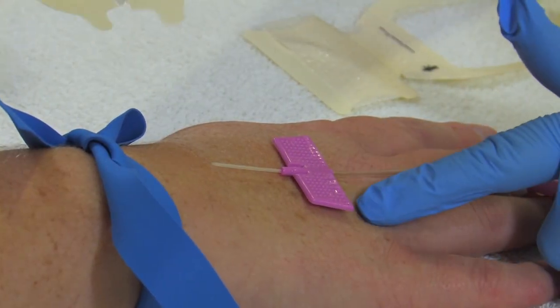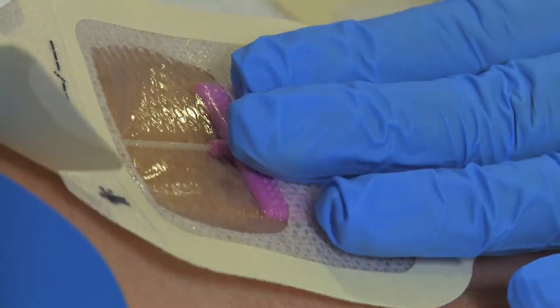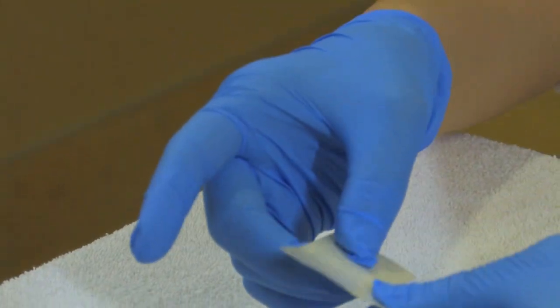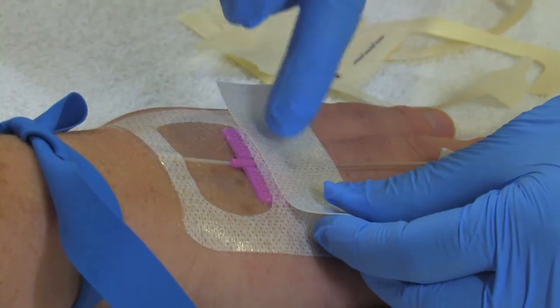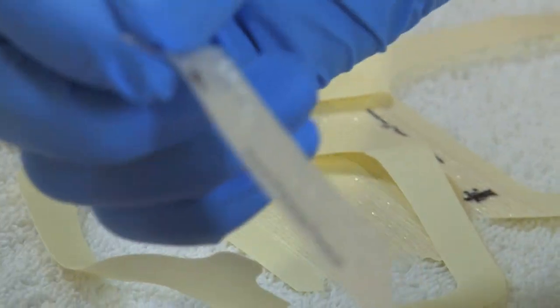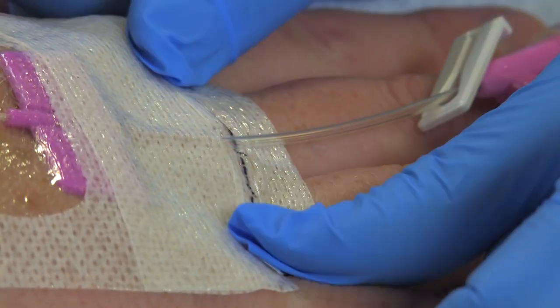So in the event that you use a butterfly catheter, you want to hold the 3M like a slice of pizza, and you want to line up this edge of the butterfly catheter with the keyhole here. And then you just want to adhere the window to the patient's skin. Then you want to take the Securement tape strip and cover the keyhole and secure it down. Last but not least, we want to date and label our strip, and then take the long edge and line it up with the 3M product underneath the catheter. And again, we want to press down nice and firm so that it adheres to the patient's skin.